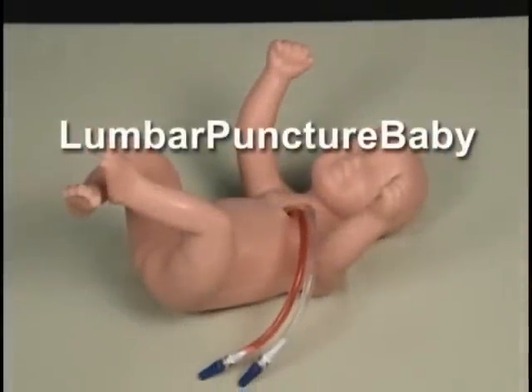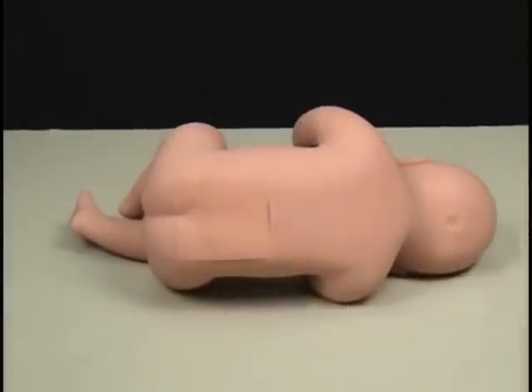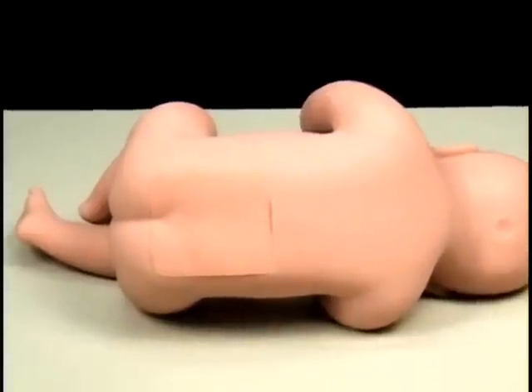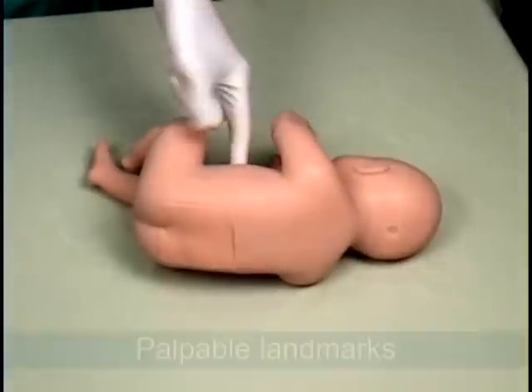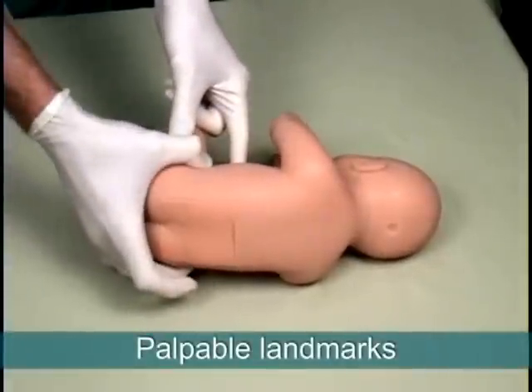Lumbar Puncture Baby is an anatomically correct soft tissue trainer that simulates a two-week-old infant. This ultrasound-compatible trainer's landmarks include the umbilicus, gluteal fold, iliac crest, and vertebrae.